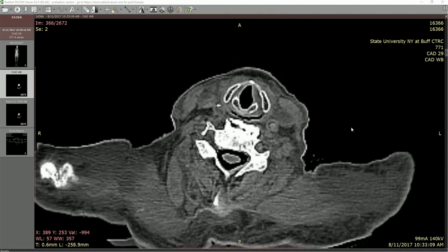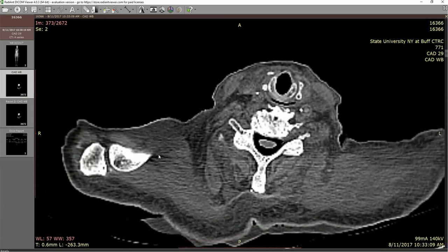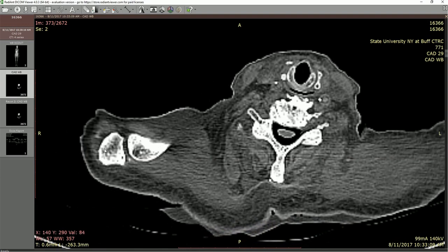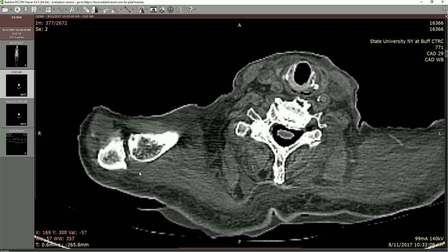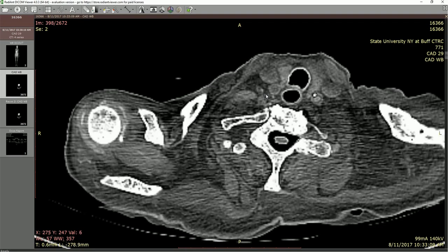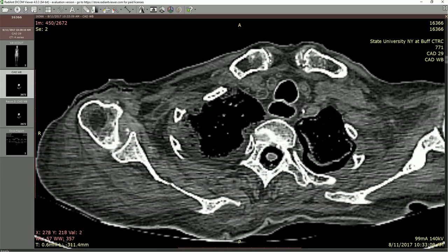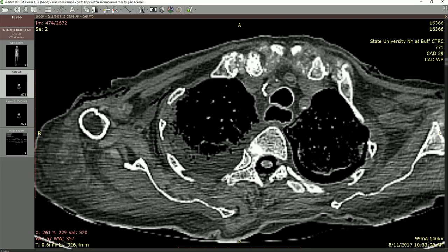As we make our way down, we start to see the form of the acromion process and the clavicle. The spot in between is going to be the acromioclavicular joint — the furthest and most superior point out on the shoulder — with a bit of the deltoid muscular tissue showing on the outside. As I scan through, the acromion leads into the spine of the scapula, and the clavicle starts moving medially to meet up with the sternum, forming your sternoclavicular joint with the manubrium. Then we have the first rib starting to appear underneath that.